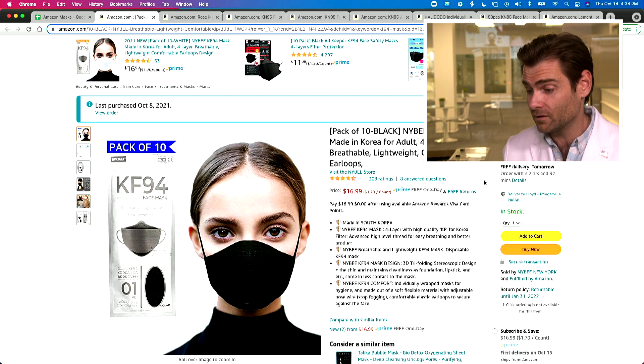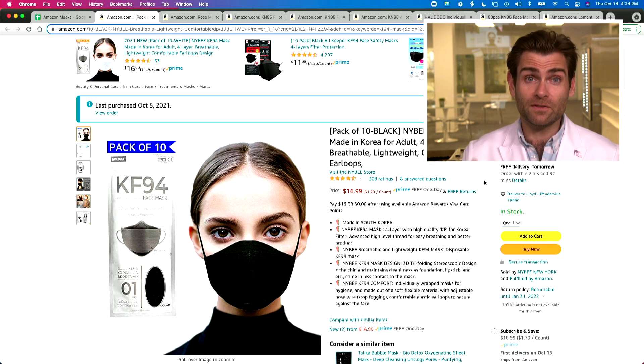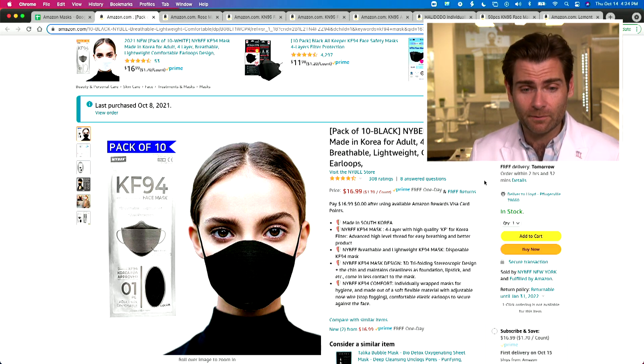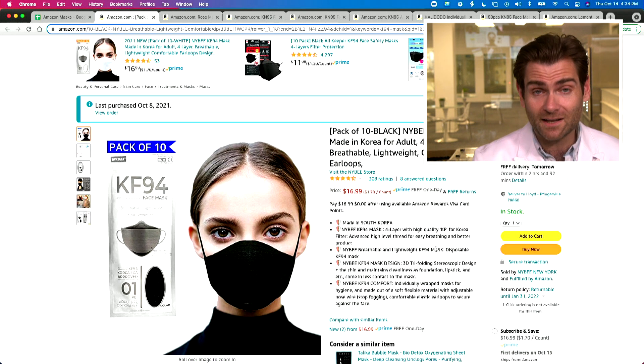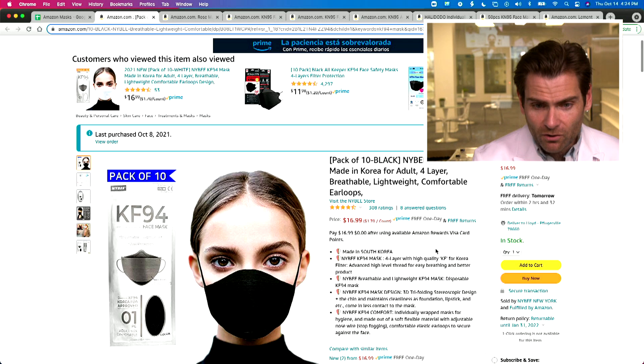I don't know what the KF-94 standard is for airflow resistance or breathability — if you know, please put it in the comments. This mask is all made in South Korea by a brand called Naibi, which I've never heard of before. There are so many good KF-94 brands — I'd probably just choose another one.